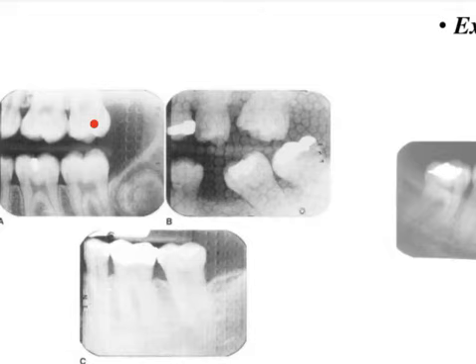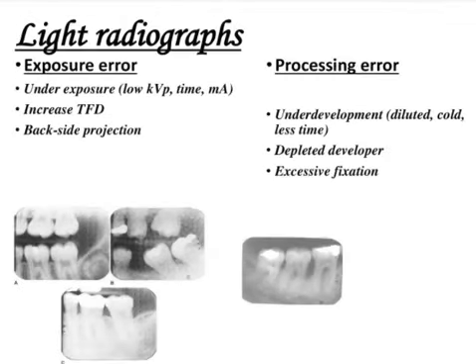Okay, so tire track appearance and herringbone pattern. These are the two patterns which you can see if you keep the back side projection. Very important question for your final exam or for your Saudi dental assistant licensing exam. Okay, then comes the processing error.